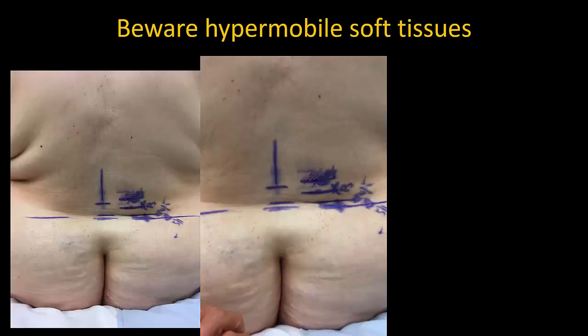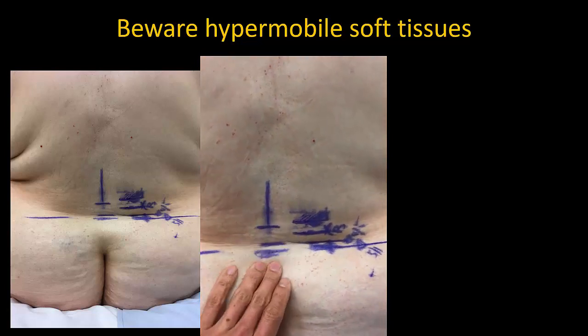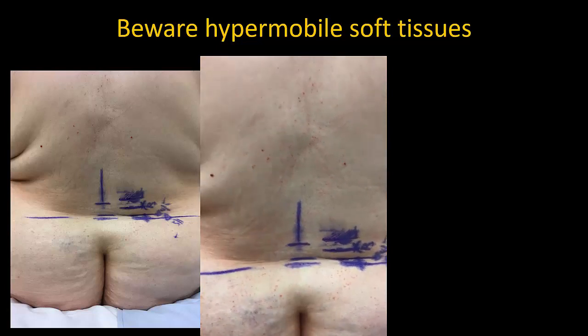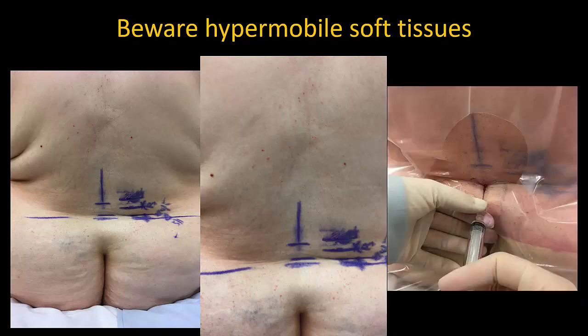Although the skin and subcutaneous tissues of obese patients are often relatively firm and less mobile than the thin elderly person, sometimes the overlying skin and tissues can be very mobile, even in the sitting position as seen here. This patient also has an unusual shelf of soft tissue. When scanning and marking the position of landmarks, therefore, one needs to be very careful that the tissues are in their natural position before marking it. And similarly, when inserting the needle, care must be taken to ensure the tissues are not moved out of their natural position.